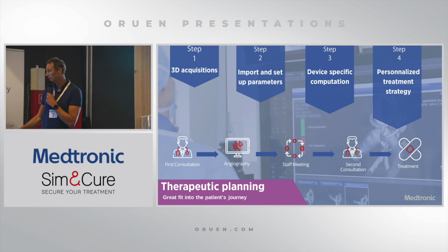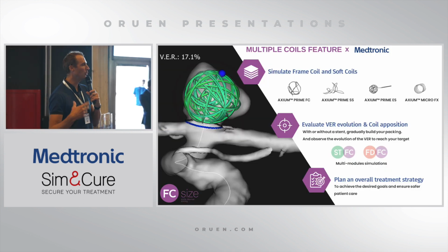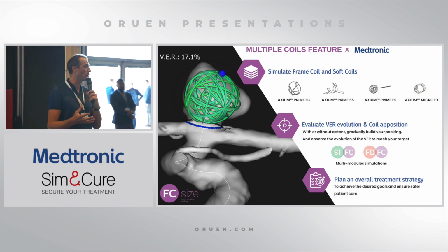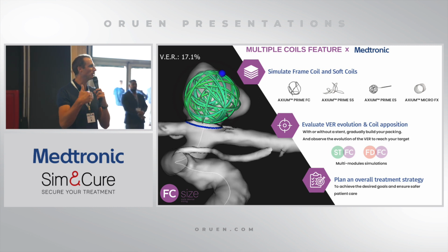And also inside the angio suite, of course, on D-Day, you have a new overview of the anatomy of the patient under general anesthesia, because the 3D may be a little bit more accurate when the patient is asleep. And then we are confirming the strategy and making the final choice of the implant size.